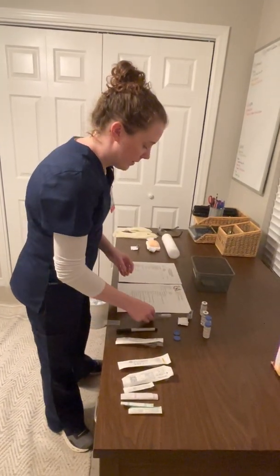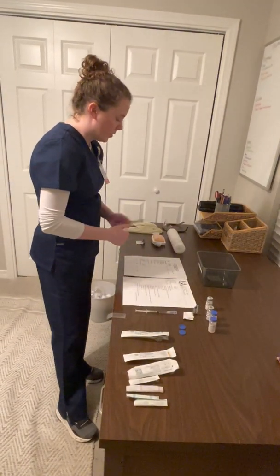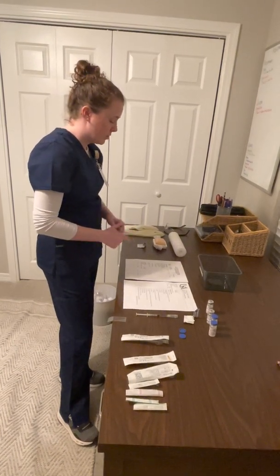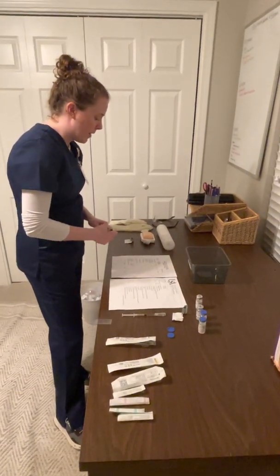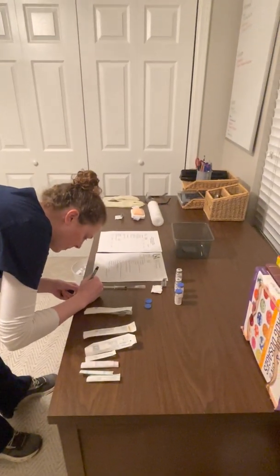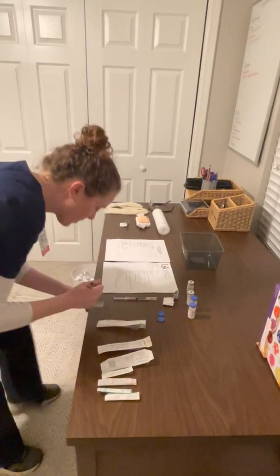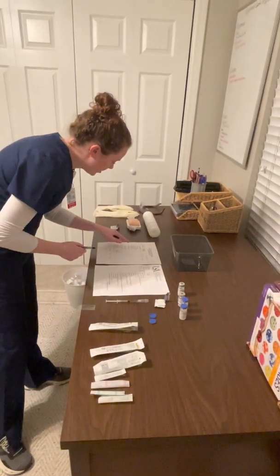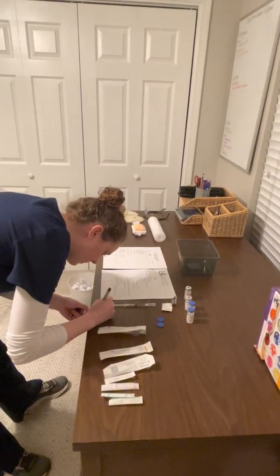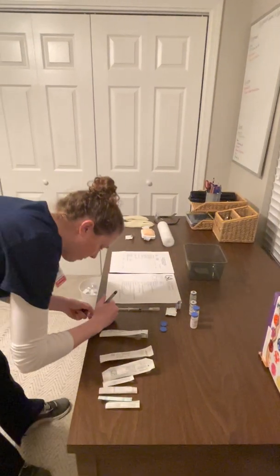Next, I'll go ahead and make a label for my syringe. So the label will include the patient's name, the medication, and the dose of the medication. So on my MAR, I can see that the patient's name is Jaguar J. Jones. The medication is heparin. And the dose is 5,000 units or 0.5 milliliters.